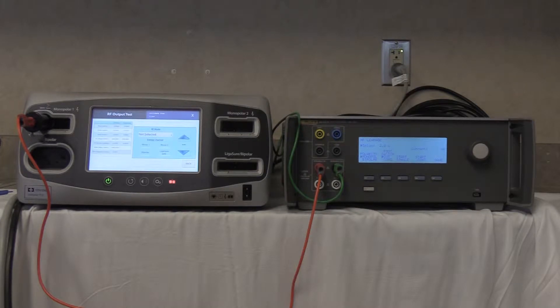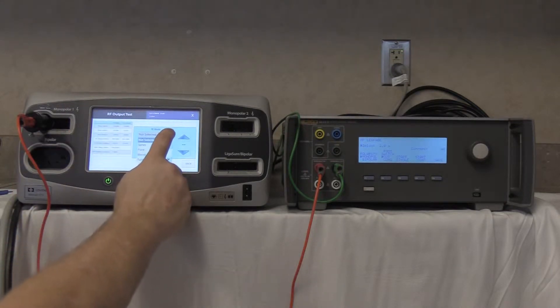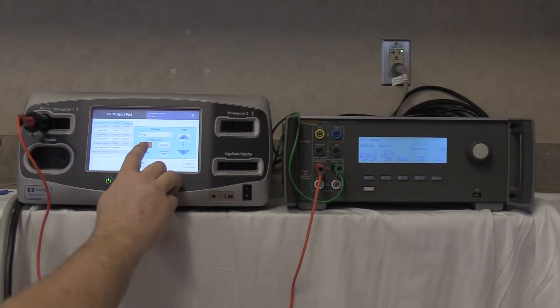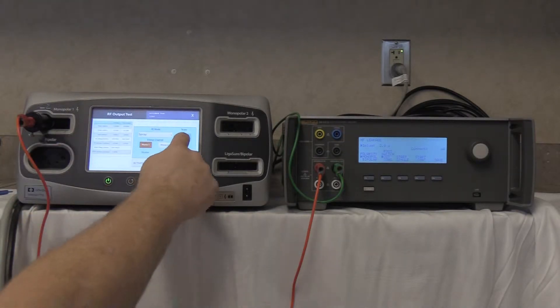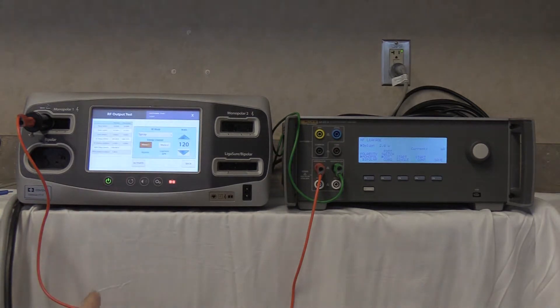Now manually activate monopolar spray on monopolar 1. Go to RF mode and select the max setting of 120 watts.